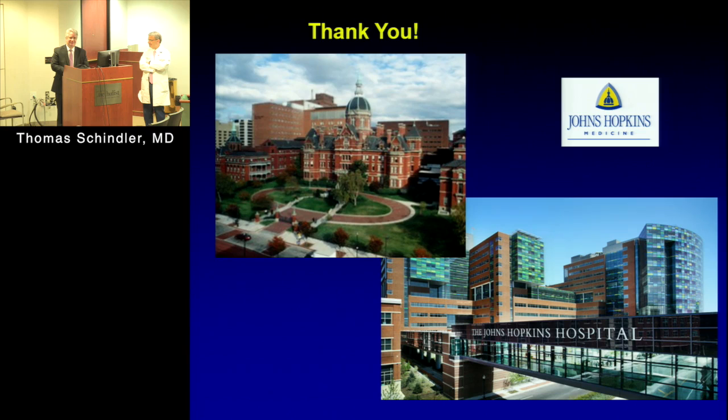The other point is, when you have sarcoid, you may have edema also in areas where there may be no granuloma, and that may explain the delayed enhancement on the MRI images. Also, you can get more information on the edema or inflammation when you do early delayed enhancement. You don't do the imaging only after 15 minutes, you do it already after 3 minutes. So you might catch the edema with a T1 sequence already at 3 minutes.